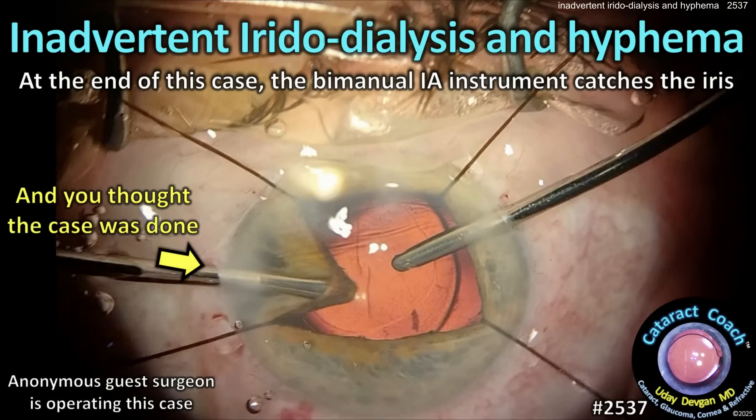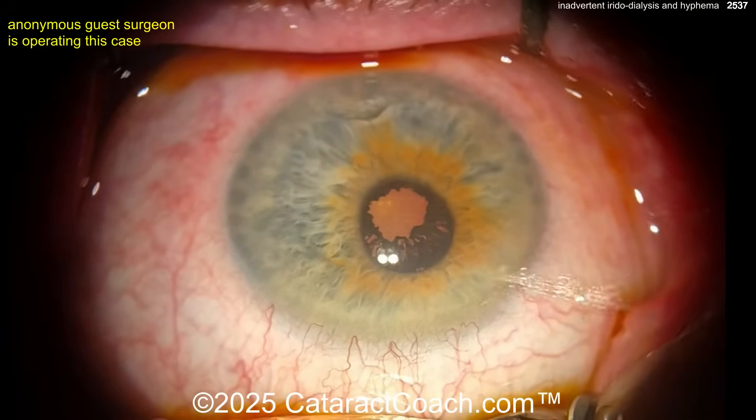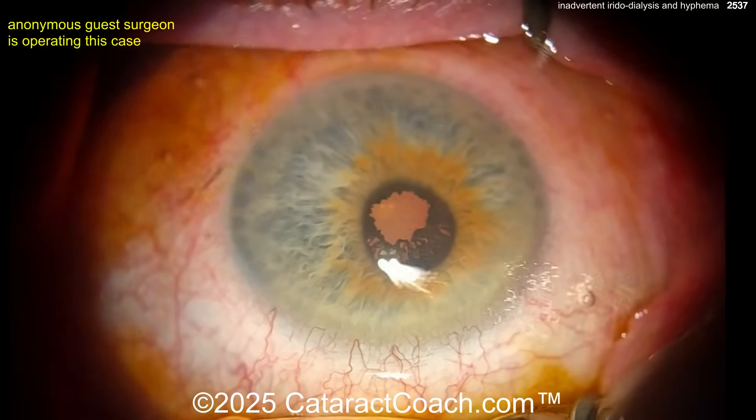From cataractcoach.com: inadvertent iridodialysis and hyphema at the end of this case. The bimanual IA instrument catches the iris, and you thought you were done with the surgery. Let's watch this case.